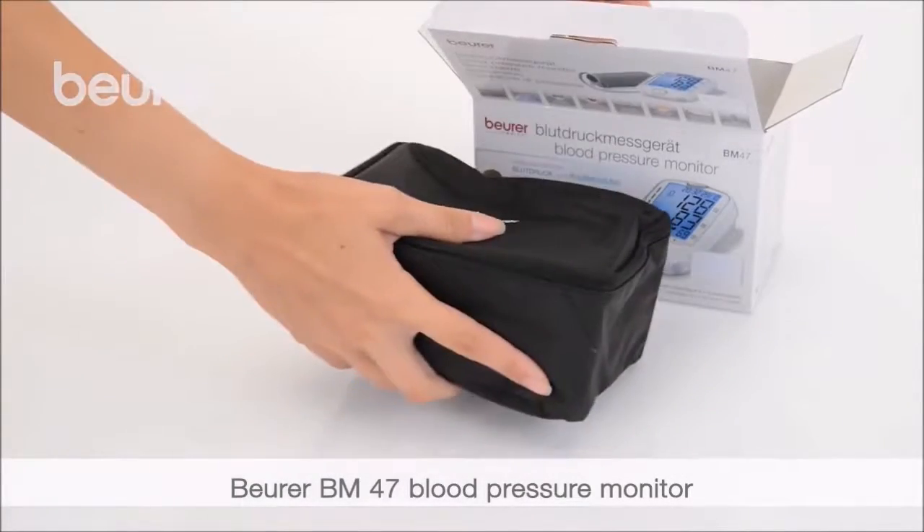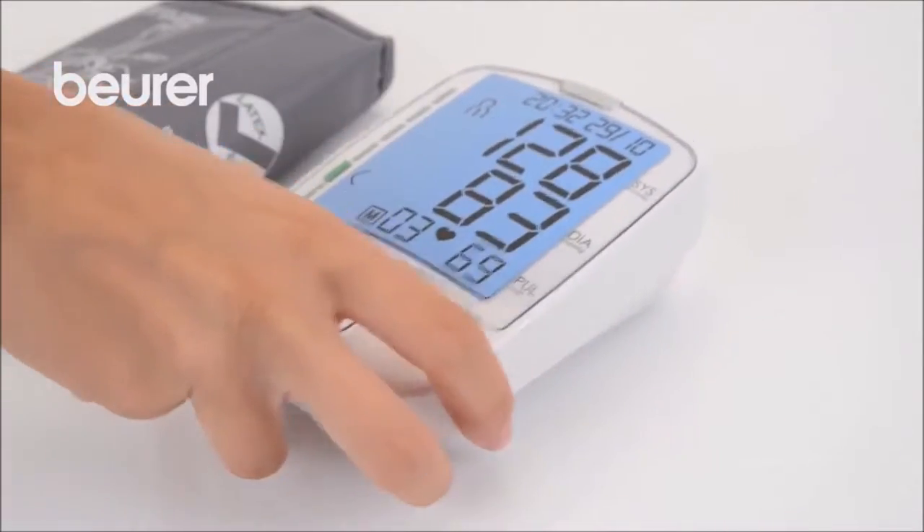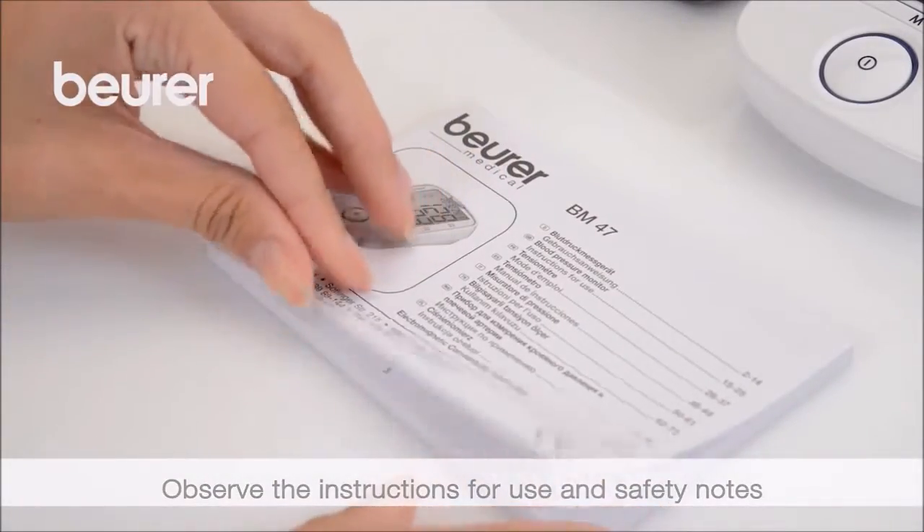Here are some tips for using your BM47 blood pressure monitor from Boira. Pay attention to the instructions for use and safety notes.